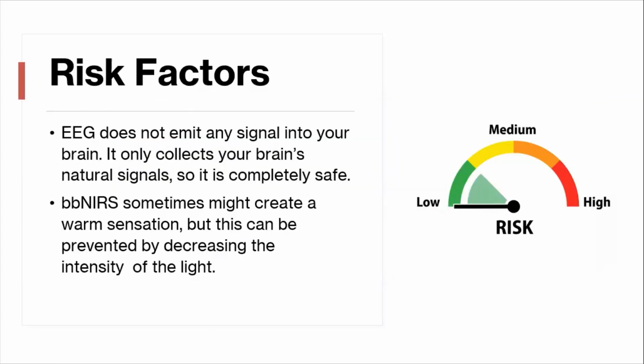The risk for this experiment is very low. EEG does not emit any signal into your brain. It just collects your brain's natural signals, so it's completely safe. bbNIRS can sometimes create a warm sensation, but this can be prevented by decreasing the intensity of the light. So if you feel any discomfort during the experiment, please let us know.